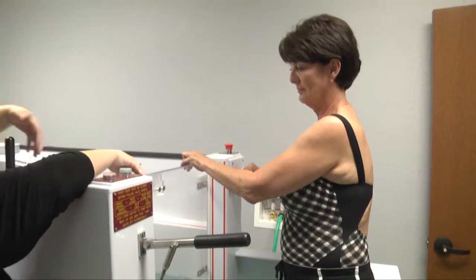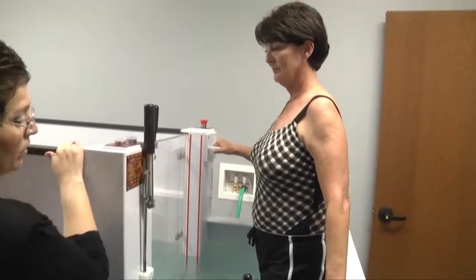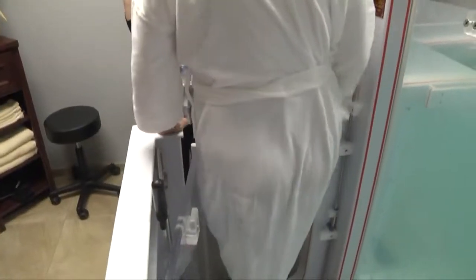Put the lever back up, hit the foyer pump button and pump the water out of the foyer. Once the foyer is empty, then you can open the foyer door and allow the patient out of the tank.